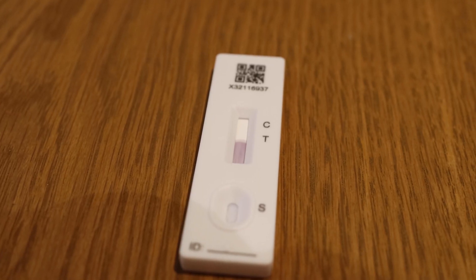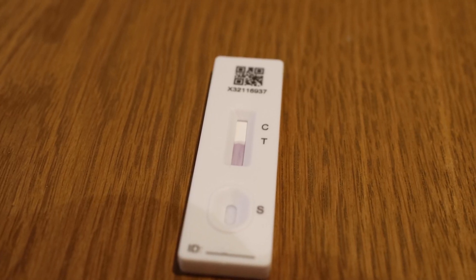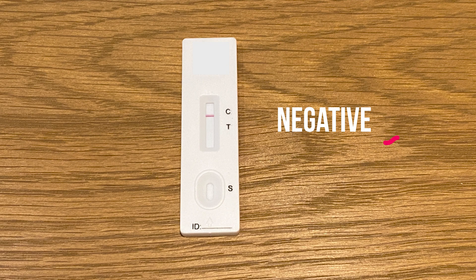This is what the test cartridge will look like as it's being processed, and this is what it should look like after 30 minutes. A negative test shows a single line where the C is — C stands for control. A positive test shows two lines: one at control and one at the test area, indicating that you do have coronavirus. If you get a positive result, follow the coronavirus isolation protocols and get a PCR test to confirm the diagnosis.